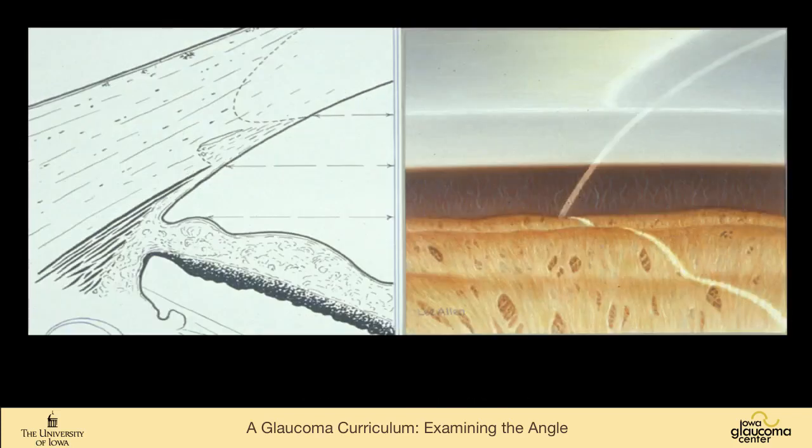Again, this is a painting we've seen before, an extremely deep insertion. This is all ciliary body face. This is scleral spur, Schwalbe line. So this would be extremely deep insertion, 55 degrees of angular width here, a flat iris, and no pigmentation. So E55F0.